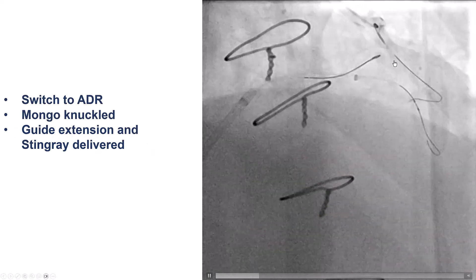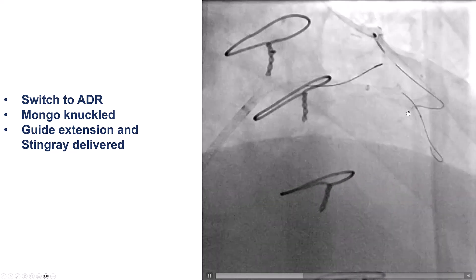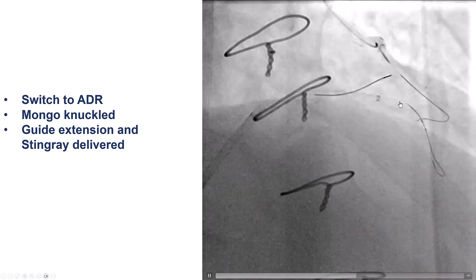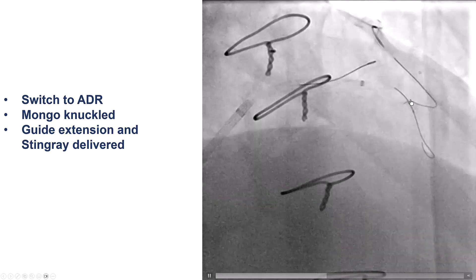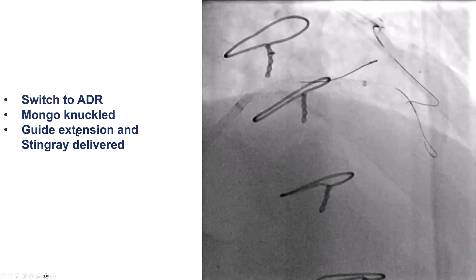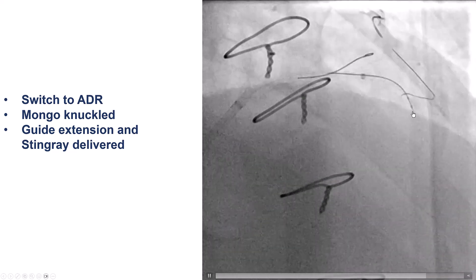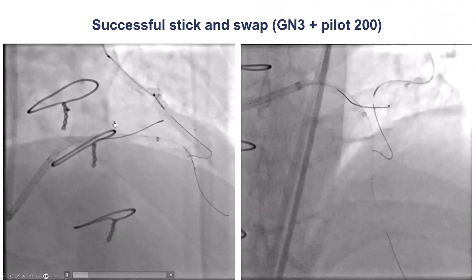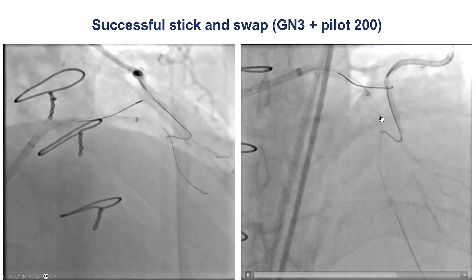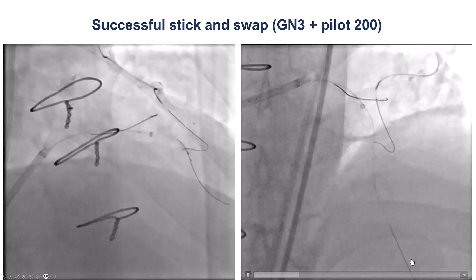The patient is hemodynamically stable, but we cannot deliver a retrograde microcatheter to puncture retrograde. So what we did is use the retrograde wire as a marker of where the vessel was. We inserted a Stingray balloon — these are the two markers of the Stingray balloon — and then did the stick and swap with the Gaia Next 3 and the Pilot 200. As you can see from the injection from the LIMA, the Pilot wire went into the distal true lumen.